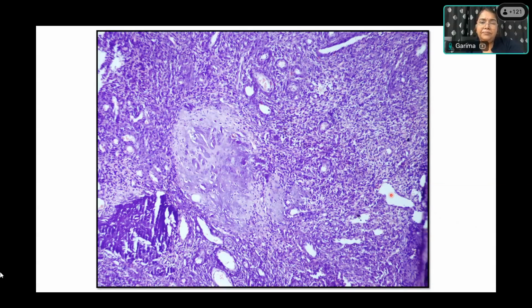These are two sides. This looks like cartilage, and these are blood vessels, right? Yes, these are blood vessels. And ma'am, are these the cholesterol plaques? No, these are not cholesterol clefts.